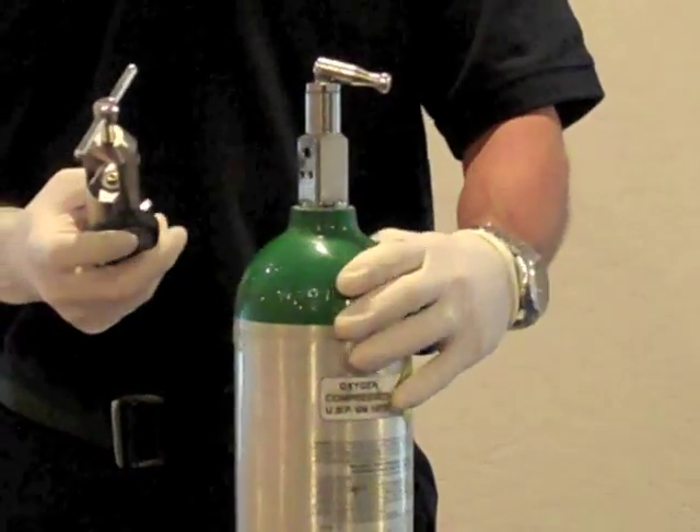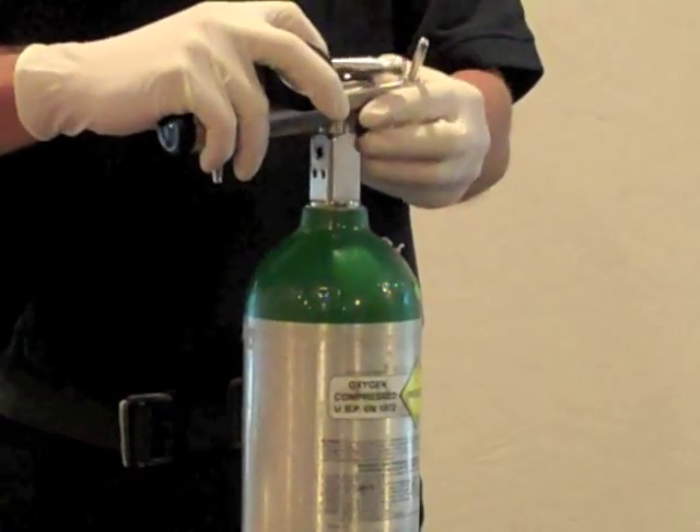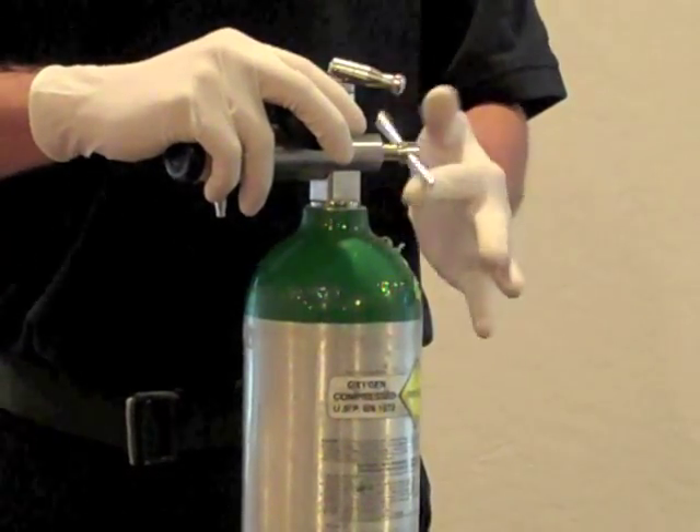Slide the regulator over the neck of the oxygen bottle, ensuring that the pin setup is on the proper side. Use the thumb wheel on the back of the regulator to tighten it down.